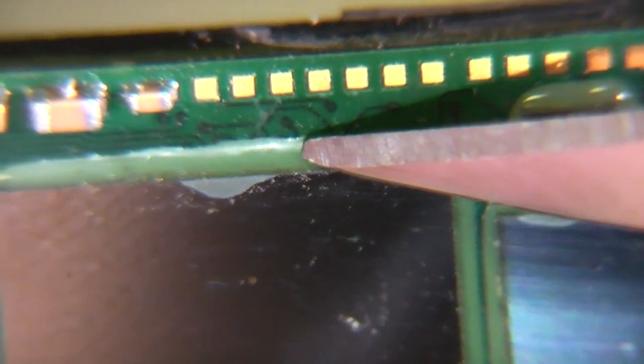I might try a bit of heat. All these chips have got this underfill, which is quite a hard sort of adhesive. I might try a bit of heat to see if I can soften that up and just peel the chip off, just to see if it's a chip or a large FET or something.